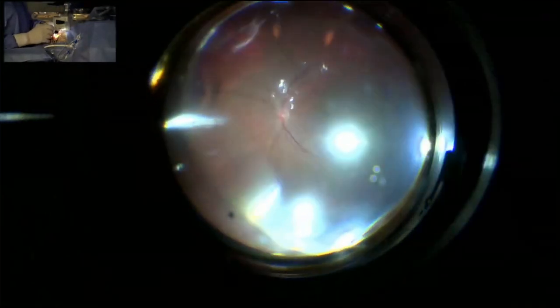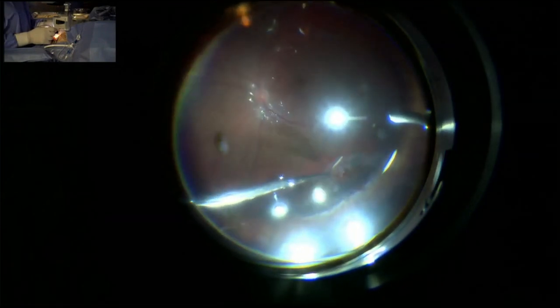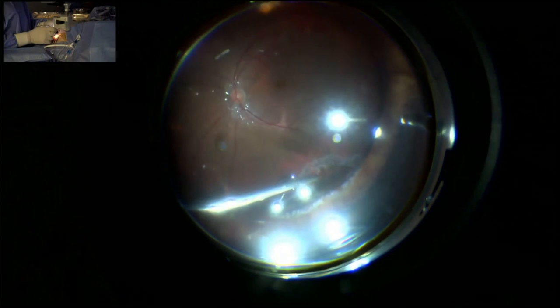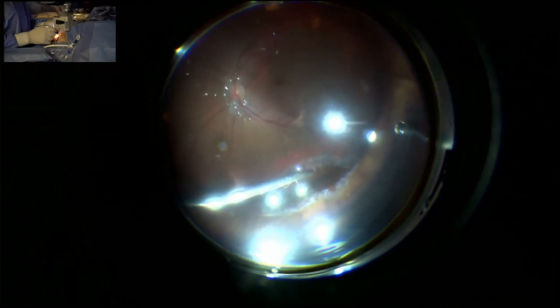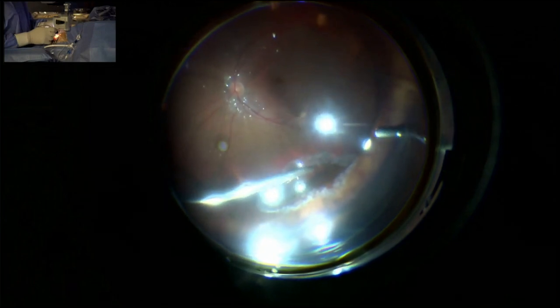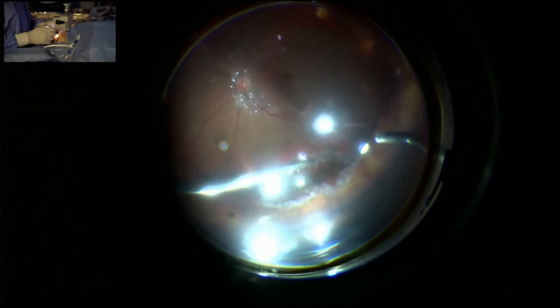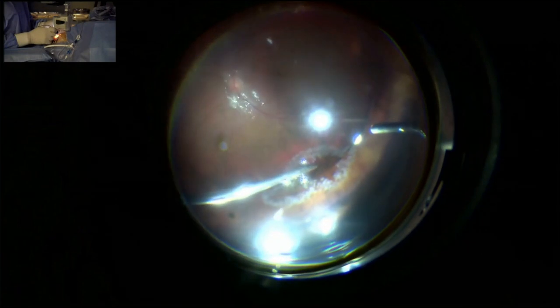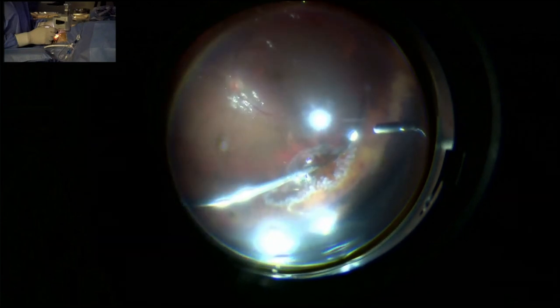After surgery, when I use 10% or 8% C3F8 and the retinal tear is superior, I keep the patient in a face down position the first day after surgery, about 12 hours, to prevent potential retinal folding in the macular area. Then, if the tear is superior, like in this patient, from the day after surgery I will keep the patient in a sitting position, not face down. But if the tear were in the inferior part, I ask the patient to keep a face down position for at least 5 to 7 days, like 12 or 16 hours a day.